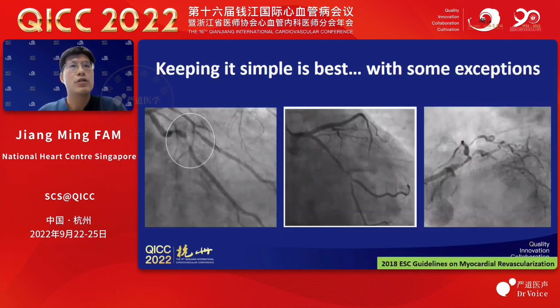Now, choice of technique. Generally speaking, the one stent technique is preferred still whenever possible. The European guidelines recommend stent implantation in main vessel only, followed by provisional balloon angioplasty with or without stenting of the side branch. Exceptions are when there's a side branch with a long ostial lesion, for example, if one anticipates difficulty in accessing an important side branch after main branch stenting, or in the setting of true distal left main bifurcations. Some examples are actually shown here.